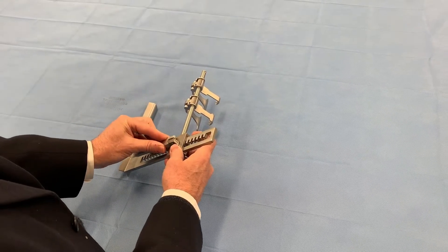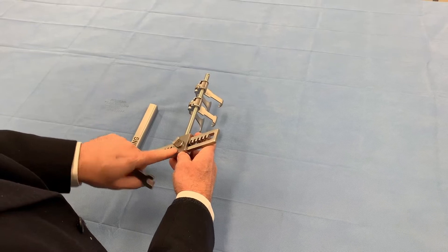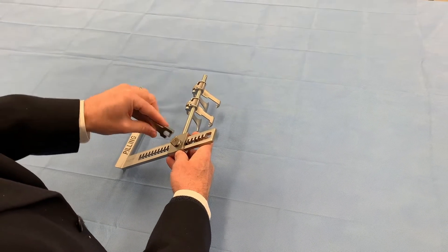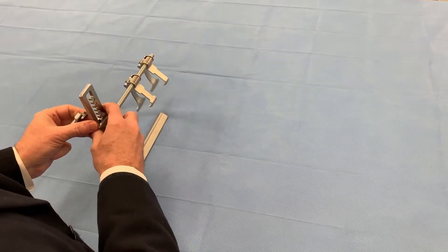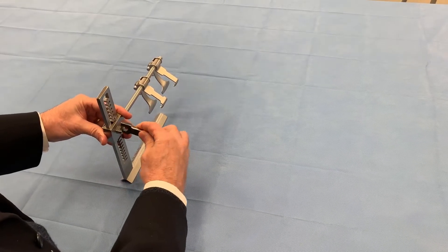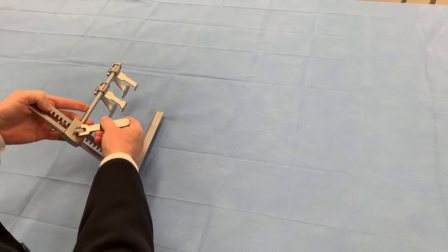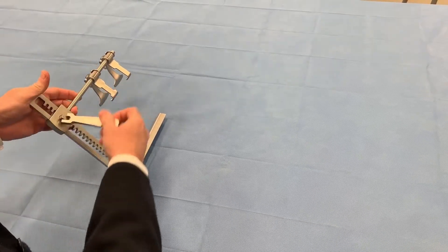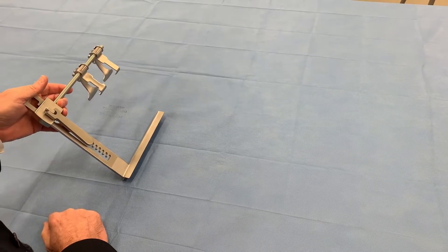If you try to remove it from the wide side here, it locks and won't come off. So you have to go straight in line — it's the skinny side, and it pops right off. So you flip this over to this side and do the same thing. You can't put it on this way; you have to put it on this way, and it just goes right in. And here you are — you can crank it, and that's your RIMA, your right internal mammary artery exposure.